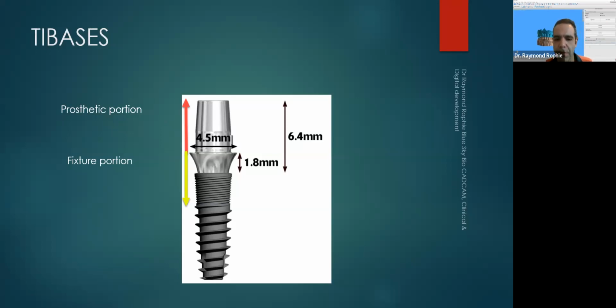What I want to explain about this is that these are abutments that I really like and enjoy working with, restoring patients with the titanium bases. The reason is that you have a perfect margin and an anti-rotational feature that will definitely work so the crowns are not rotating on the axis of the abutment. As well, you have an emergence profile.